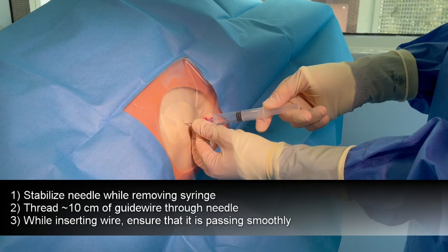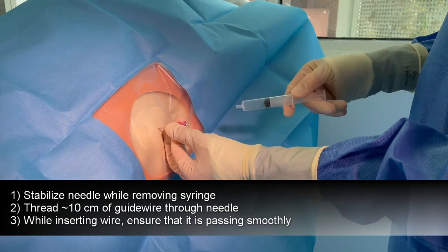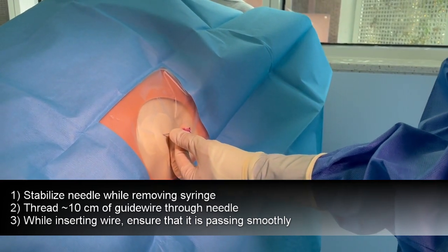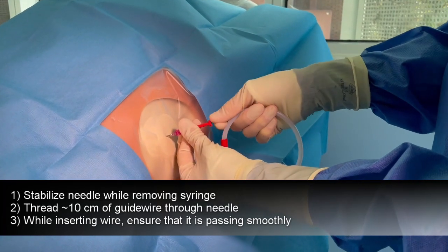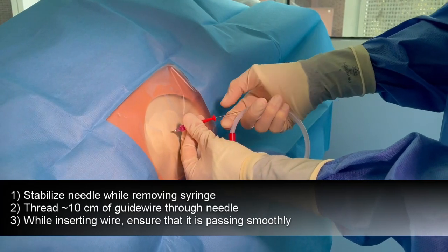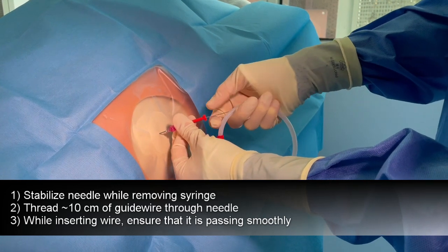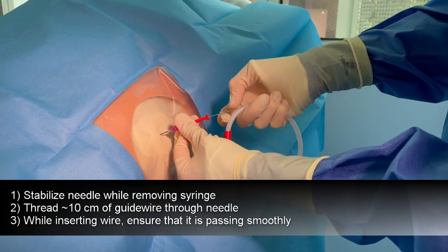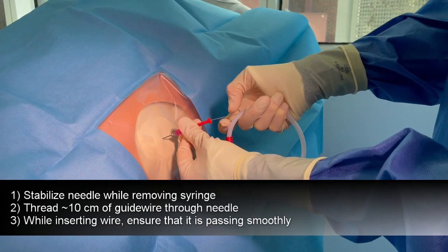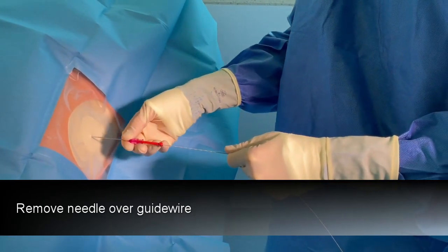Then, with your non-dominant hand, stabilize the needle. Remove the syringe with your dominant hand. Then take your guide wire and thread the wire through the needle. You're aiming to get about 10 centimeters worth of wire through the needle. Make sure that it passes smoothly. Then remove the needle over the wire.